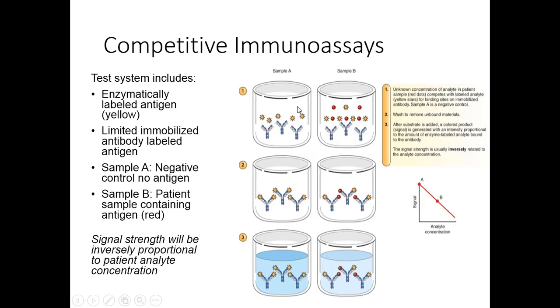There's no little red dots. So is there any competition for these unbound Fab reagents? There really isn't. These antigens are all going to bind off. And you can see, because this is always in excess, we bound off 100% of the antibody binding sites. We just made a complex here, didn't we? We made the antigen that we added plus the antibody, and now they're complexed together. We have an antigen-antibody complex.